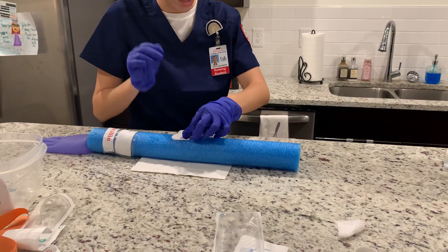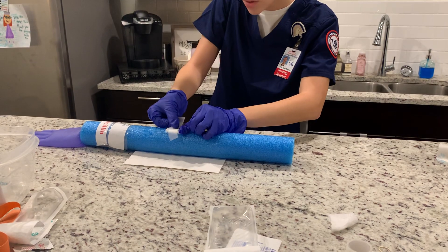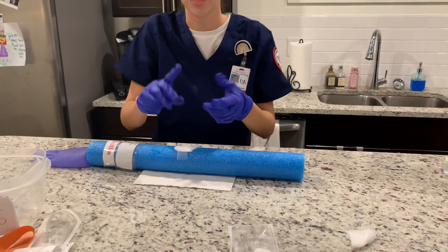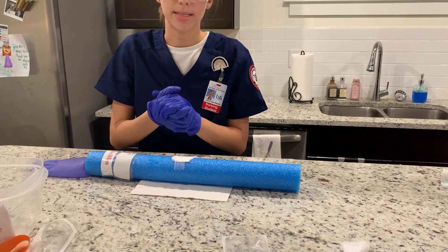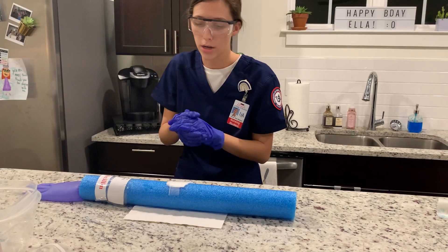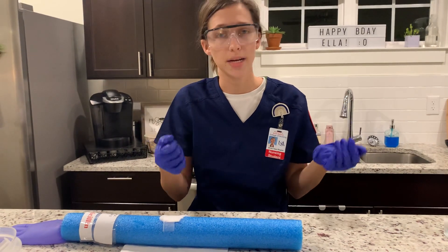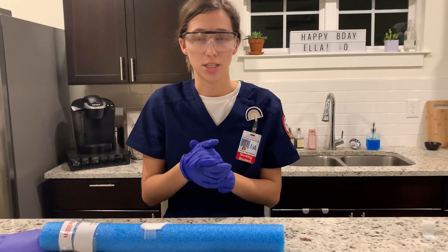Now I'm going to tape the gauze to my patient and observe for any complications such as redness, tenderness, swelling, or pain. I'm going to make sure the patient is comfortable, positioned safely, the bed is at the lowest setting, side rails are raised, and the call light is within reach. Then I would go to the nursing station to document.